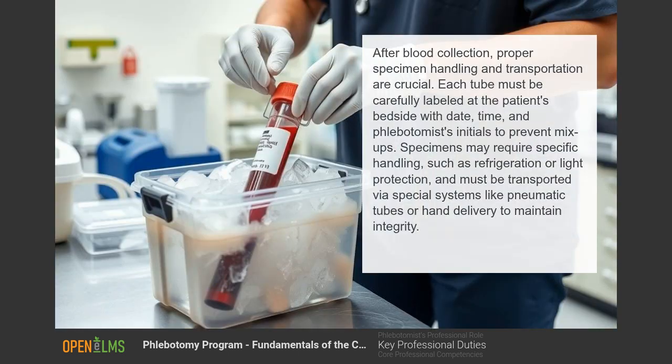After blood collection, proper specimen handling and transportation are crucial. Each tube must be carefully labelled at the patient's bedside with date, time, and phlebotomist's initials to prevent mix-ups. Specimens may require specific handling, such as refrigeration or light protection.